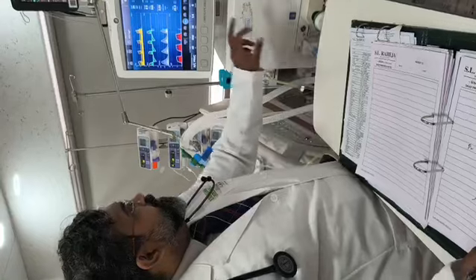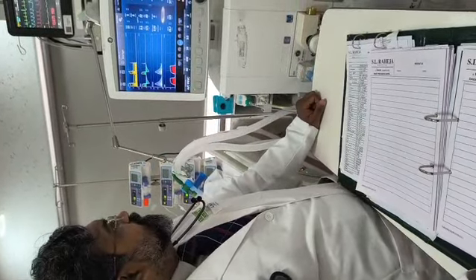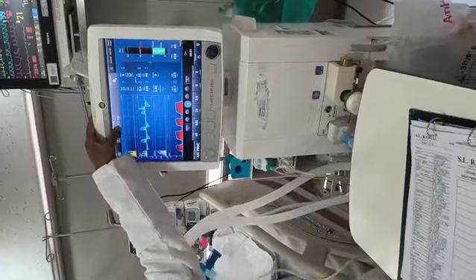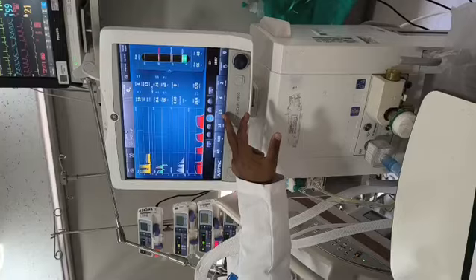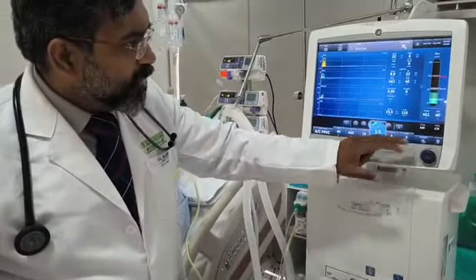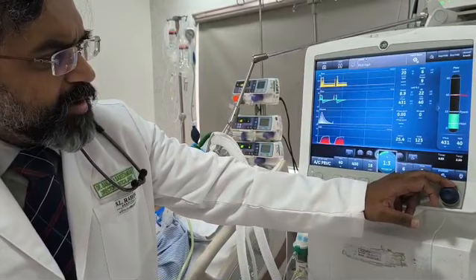It's a flow artifact. By increasing it to 1:5, maybe if I have very high amount of pressures going in, it may reduce it. It has reduced it, but it will have a small dip at the end, which basically indicates over distension. Double trigger and other problems will start the moment we do something like that, because it's just too small for a breath. Such a small inspiratory ratio will make the patient have probable double trigger. That's very important to know. That's why we go back to 1:2, and accept that artifact.